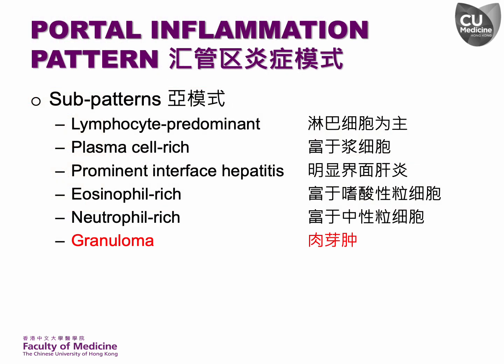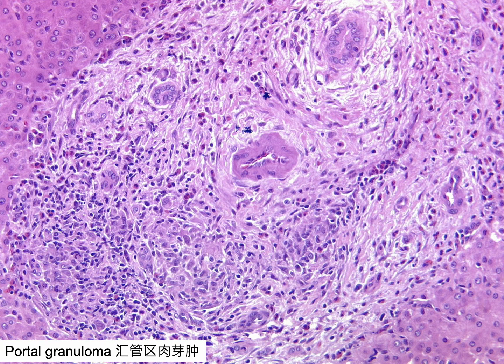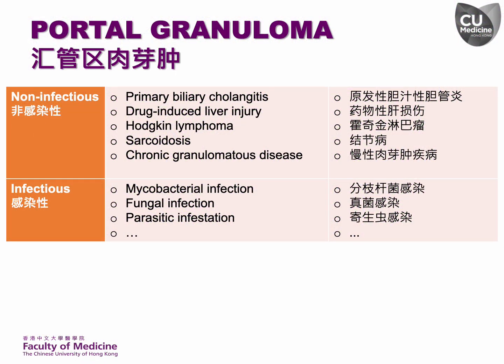Last but not least is the portal granuloma or granulomatous inflammation. There is a non-caseating epithelioid granuloma present in a portal tract. An unpaired hepatic artery is observed without an accompanying interlobular bile duct. In this portal tract, there is a vague non-caseating epithelioid granuloma. This table outlines the primary differential diagnosis for portal granuloma, which may have infectious or non-infectious origins.